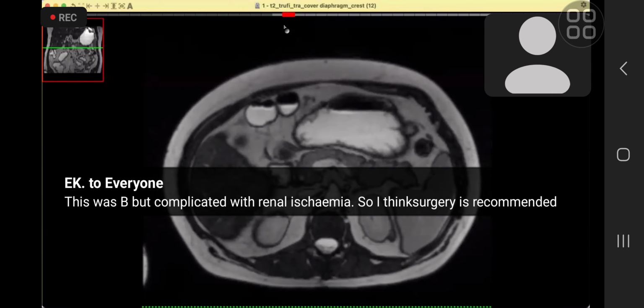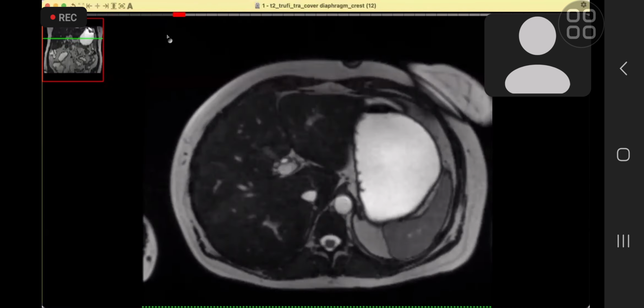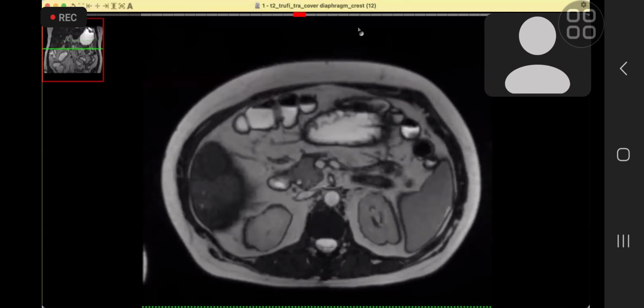I would like to look also at the liver, spleen and gallbladder stones. Don't worry about the liver, we know that there is a bit of fatty liver and gallstones. We are not interested. Okay.